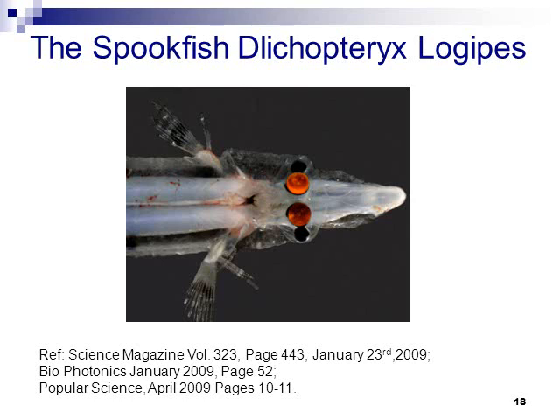Intraocular mirrors and evolution. When we started the project of implanting mirrors inside the eye several years ago, we thought that it might create unanticipated problems. After all, it was never used inside living eyes. But fortunately, several years ago, a group of European scientists found the first creature that uses mirrors to direct light towards its retina. It was found deep in the ocean, 700 to 1200 meters deep. This was unknown to us when we started to develop the idea of using intraocular mirrors inside a human eye. But the fact that nature developed such a possibility proves that a mirror can actually be used for directing light towards the retina. So we are happy to declare that God or evolution was first, and we're just following what was created by nature, not trying to play God.